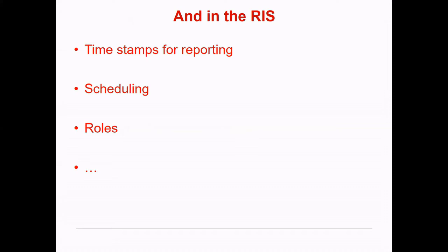Now, the RIS actually is also a really interesting source of information, and I'll show you in a second what we used it for. What was very interesting for me is that it has the timestamps of the radiologist reporting. So I can really see when they started dictating and when they stopped. And I can see how long it took from them to the senior physician and when they signed off. We can then see how much, for instance, changed in the report from the junior physician to the senior physician. And we can then analyze, well, what did they actually change? And over years, we can analyze, did they learn? Did they have to change less or more? We can give feedback to the senior physicians if they only change things that are very unimportant, just to look like they're busy.